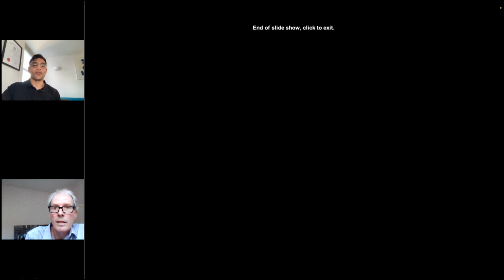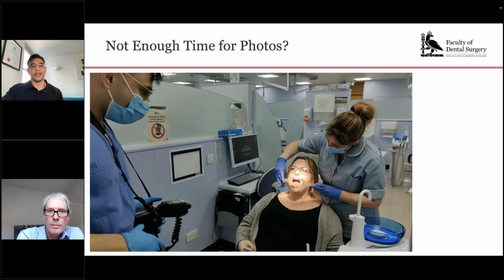Yeah, that's a good point. If you search Canon ring flash diffuser, there's a website, and it's probably the third entry on Google. There's only one manufacturer in the UK that really does a ring flash diffuser. I can bring it up again.